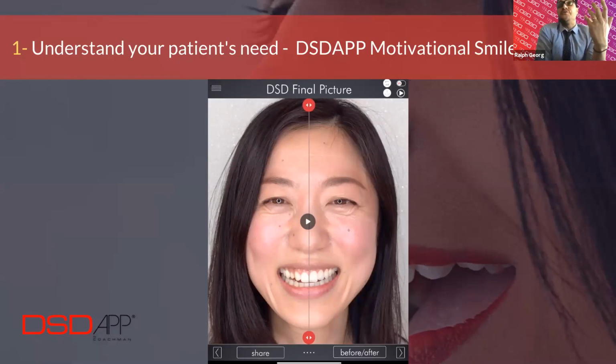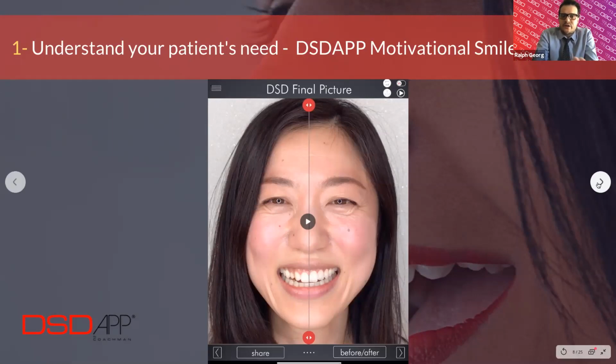It also gives them a feeling of confidence that they chose the right dentist, because you, being in charge of their oral health, are in the top tier, using technology to show them. We get amazing feedback when we speak to our dentists who are our clients and they're using this for the first time on their patients. The feedback is amazing. So yeah, absolutely.